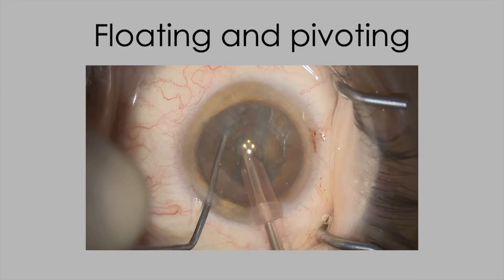The counter argument is you want to make your paracentesis small so that you don't have problems with iris prolapse. Well, you won't if you don't press down posteriorly. The thing I'll be emphasizing throughout this video series is the value of floating and pivoting in your entry sites, and not moving the eye around and not exerting posterior pressure.